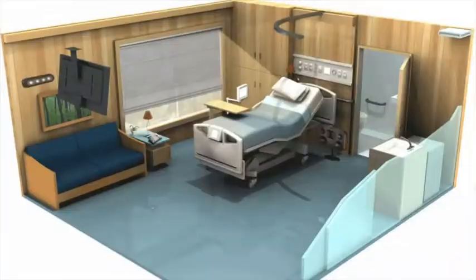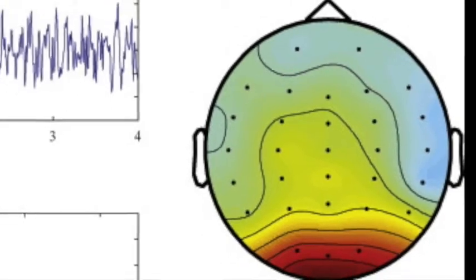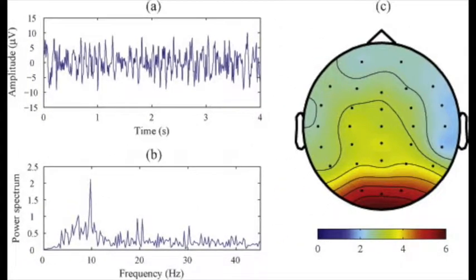The lights can be controlled by looking at the flashing LED array to elicit an SSVEP response. For example, in the image, a 10 Hz stimulus causes the occipital lobe to light up and have a 10 Hz frequency spike in graph B. In order to minimize risks to the photosensitive population, the LED array uses dot-shaped green lights that are 2.5 cm in diameter. Our array uses a 15 Hz frequency stimulus to prevent crosstalk with alpha rhythms and elicit a 15 Hz SSVEP response in the occipital lobe.